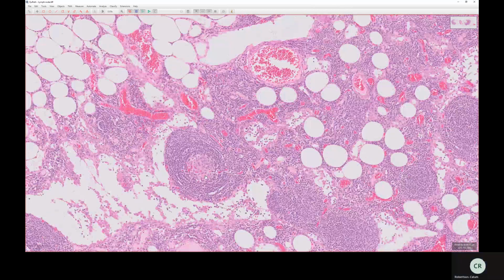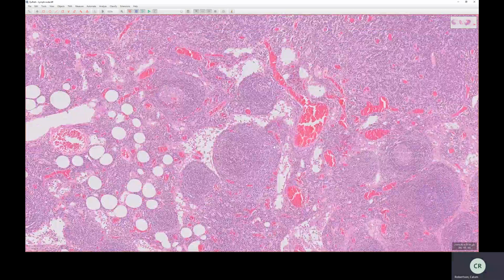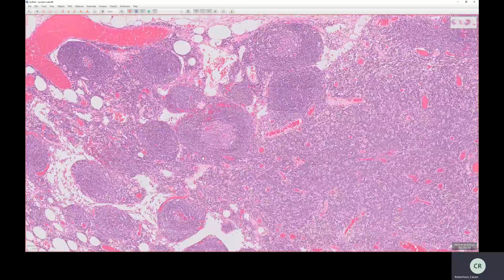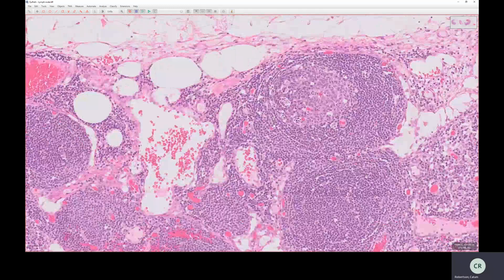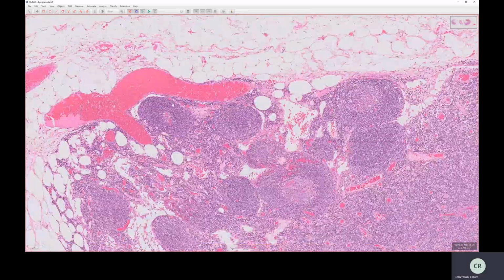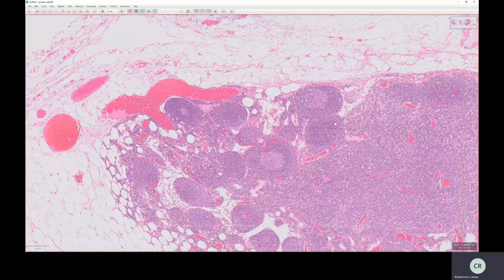So that's the germinal center, and these are follicles. So these are all secondary follicles. So surrounding the follicles, there are these collections of inactivated B lymphocytes, and they form the mantle zone. And they're around all of these. You can almost line them up in rows here. These form the mantle zones. So we've got the germinal centers of secondary follicles, and the primary follicles, surrounded by mantle zones of inactivated B cells.